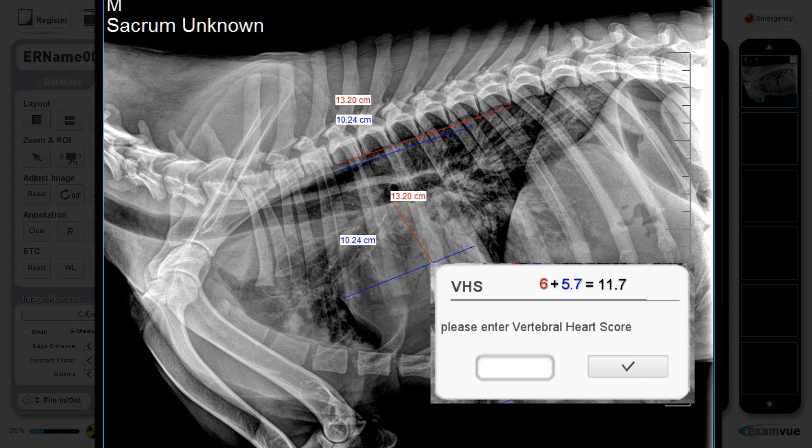Add the two measurements together and enter the sum into the VHS box. Click Save.